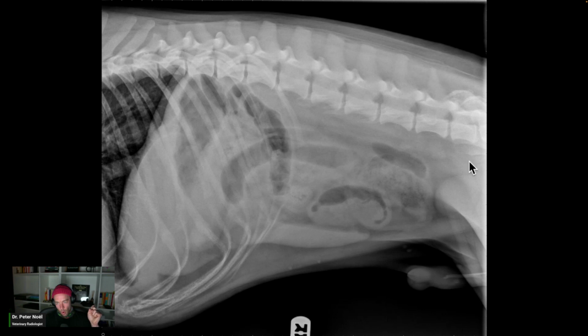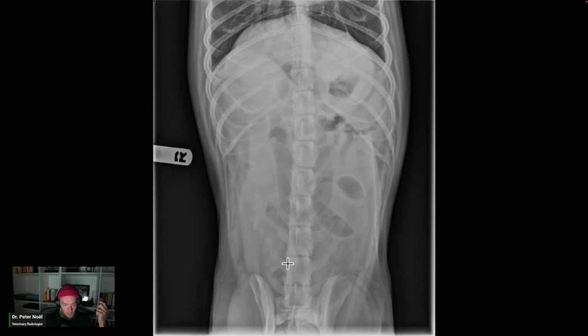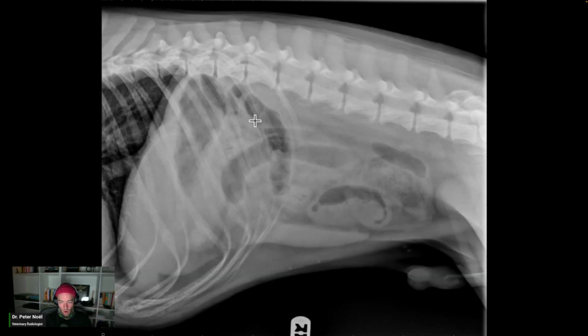So this is colon coming through here, but I lose it. I don't think that's it. Could be it, but I don't know. So the colon should come through here, right? And so it should be in here. So once you can identify the colon, I'm not sure that's it. It goes through there. It's supposed to be around here. So this is the tough test because I'm having a hard time seeing the colon.